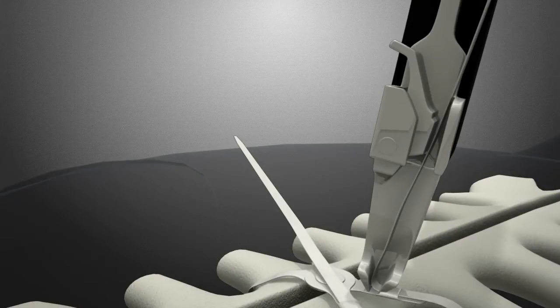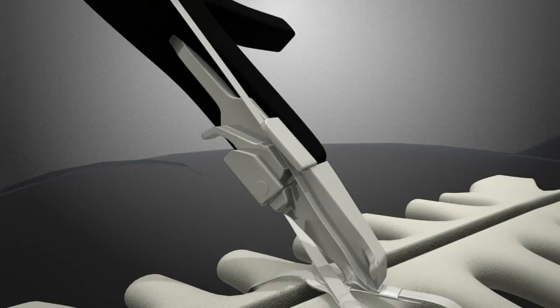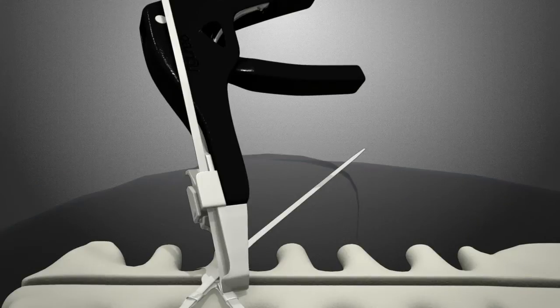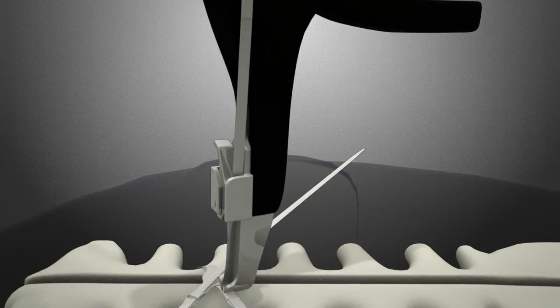By adjusting your hand position, the strap tool interface will experience lower force and remain functional. When the sternal halves nearly touch, then the strap is brought up to 90 degrees and the tool is removed from the strap.